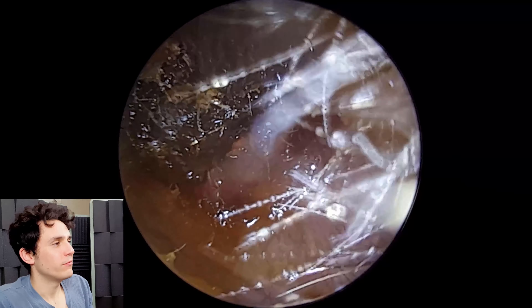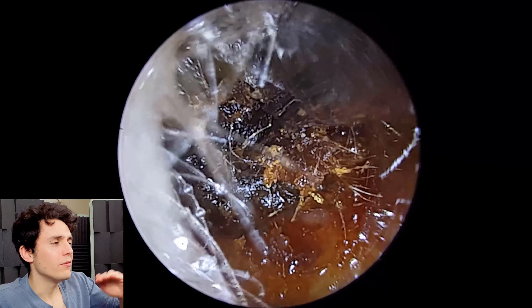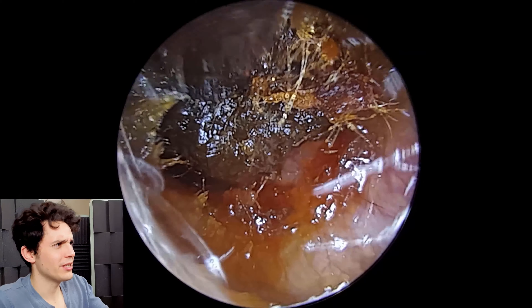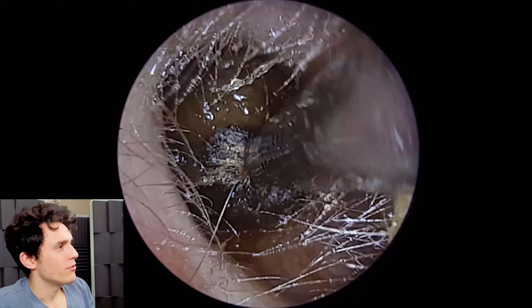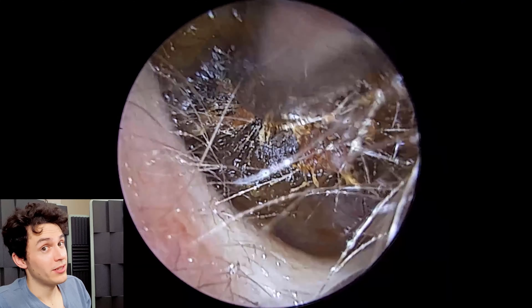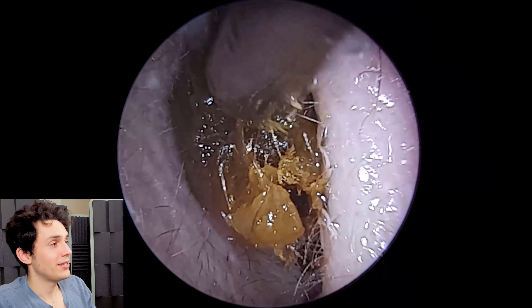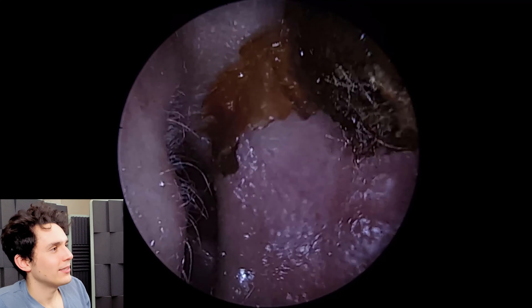As you can see I'm just wiggling it back and forth to try and loosen it up. For some reason the actual top half of this sort of iceberg piece was really soft, so I ended up rolling it before dragging it out of the canal — and you can see there's hair mixed in with it as well. We're finally making some progress and you can just about see the top half, how it's all gooey and mushy. I'll rotate it, catch it on the top, roll it over, and then drag it out. The aperture of the ear canal is quite thin compared to the earwax piece, but there we have it — with that little tail at the end, like a kite.